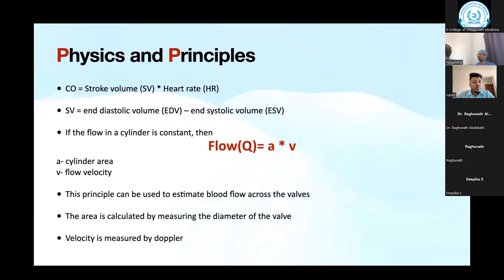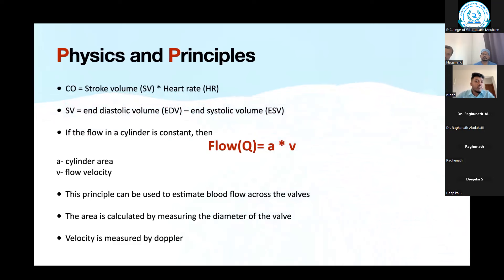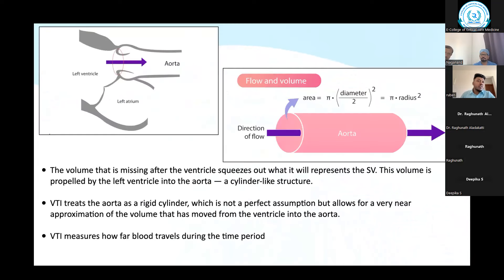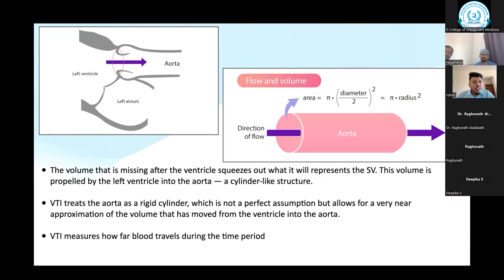Looking at the image: the first upper-left image shows left atrium, left ventricle, and the left ventricular outflow tract. At the level of the aortic opening, when the valves are completely open, that cross-sectional area is what we want. We consider it as a cylinder from the aorta opening. VTI treats the aorta as a rigid cylinder — not a perfect assumption, but allows a near approximation of the volume moved from the ventricle into the aorta during a heartbeat.